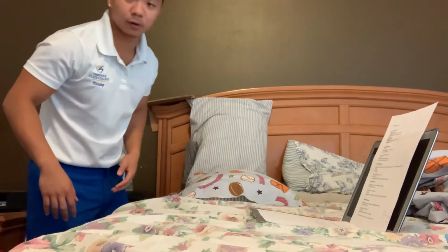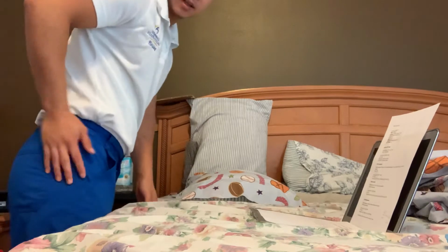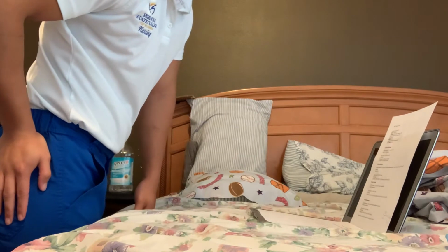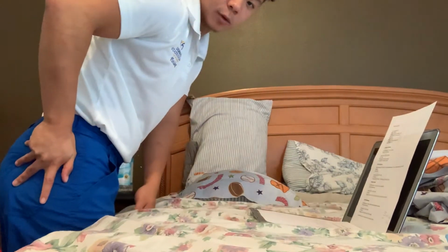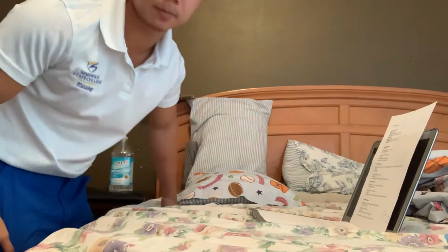The next site is going to be the ventrogluteal, and for the patient, I would put my right hand on the left side and my left hand on the right side of the patient. But for this, I'm just going to show you that I'll put the heel of my hand on the greater trochanter bone, and I'm gonna place my index finger along over the anterior superior iliac spine and extend the middle fingers towards the buttocks, creating a V shape. And in the middle of that V shape right here is the injection site for the ventrogluteal.